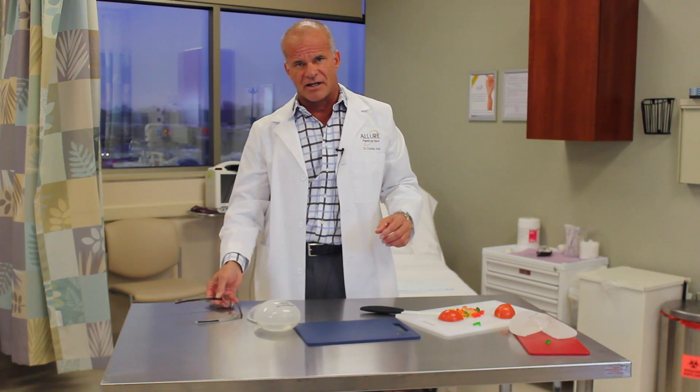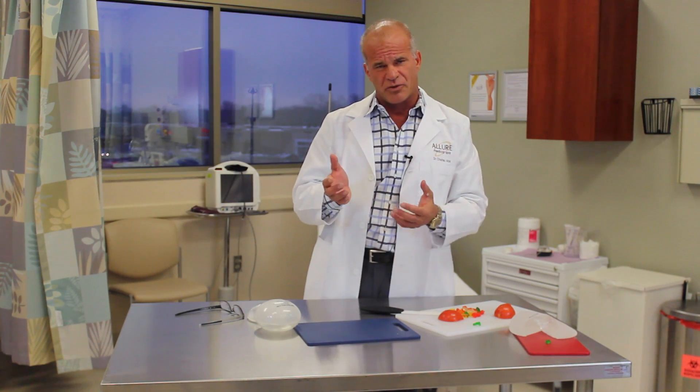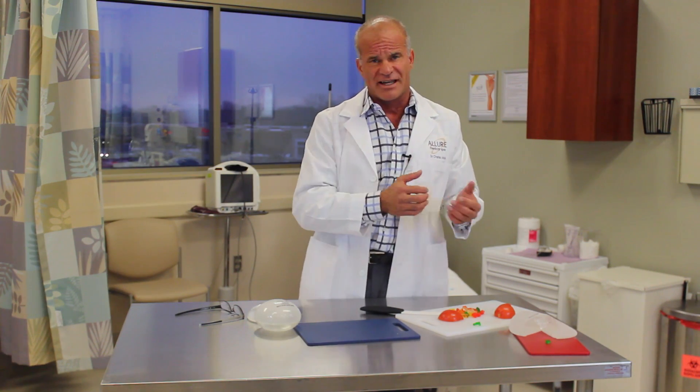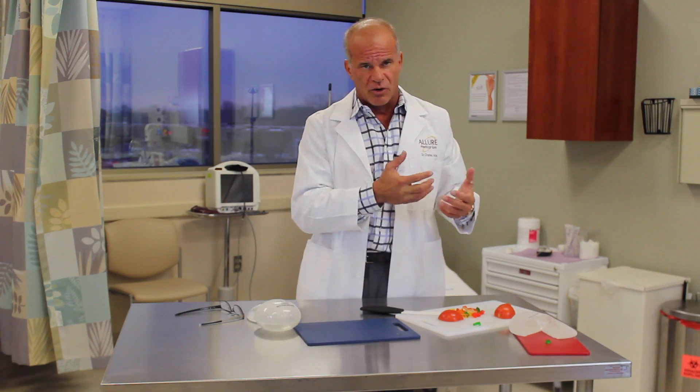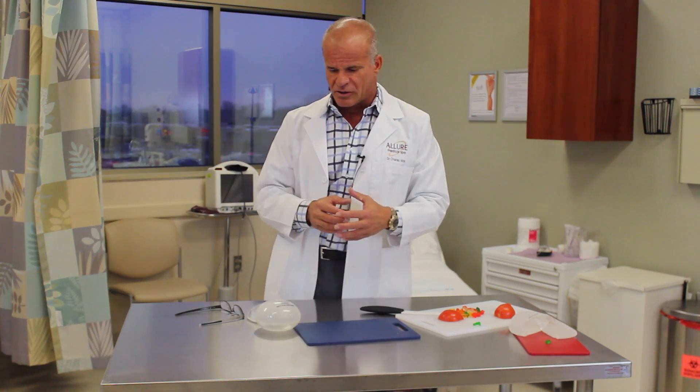The advantage of the gummy bear implant — the true gummy bear implant — is that the gel is very form stable, so when you hold it on its edge it doesn't deform. If it does get damaged 10, 20, or 30 years from now, the material will stay inside, unlike the typical silicone implant which does have a little leakage issue.